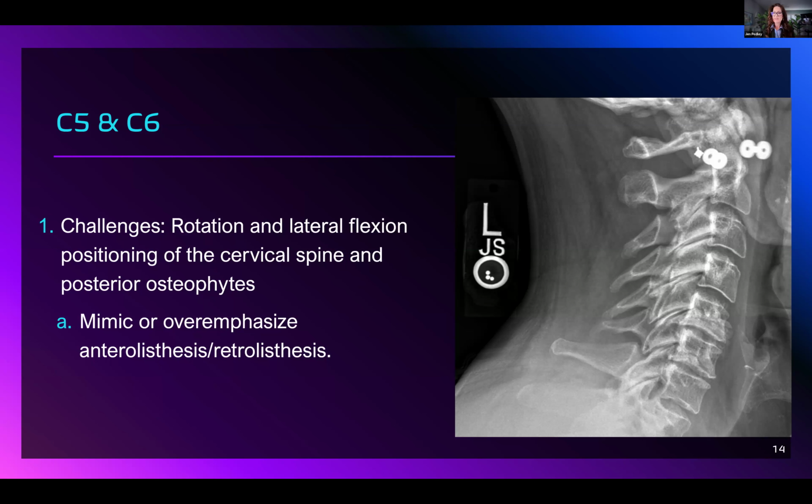It can be challenging because some of your patients have muscle spasms and a really hard time flexing and extending anyway. If your patient can't flex and extend the cervical spine, it's okay to take that first set of x-rays because it shows they can't. But you're going to have to repeat those x-rays later on when they can flex and extend, so we can really see whether those ligaments are intact or not.